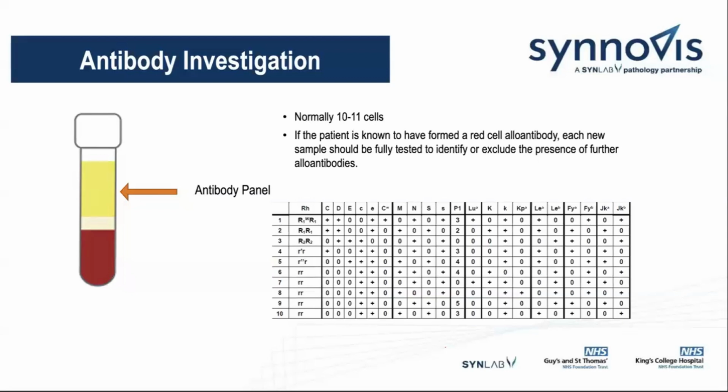Sometimes we require 3 samples because we need to do a large amount of analysis on the plasma to identify the antibodies, as we do the work in-house and then we need to send the samples away. As the reference centre, they have access to a number of different techniques and rare reagents that we don't have in-house. Sometimes it can lead to a delay in our results for our patients because it needs to be sent away for that specialist testing.